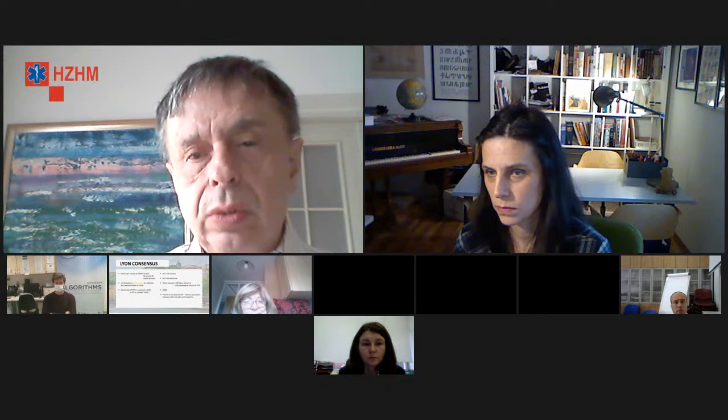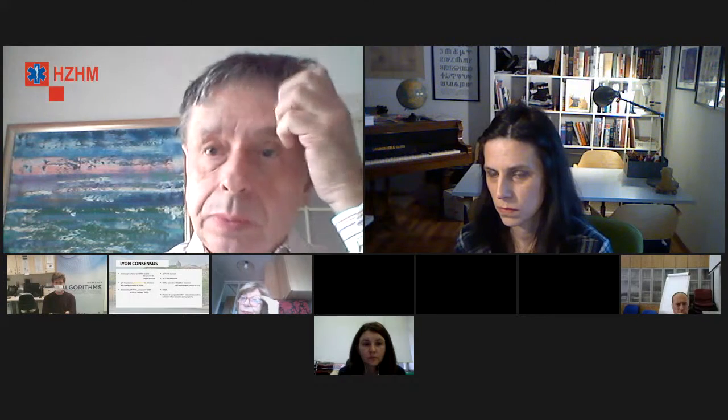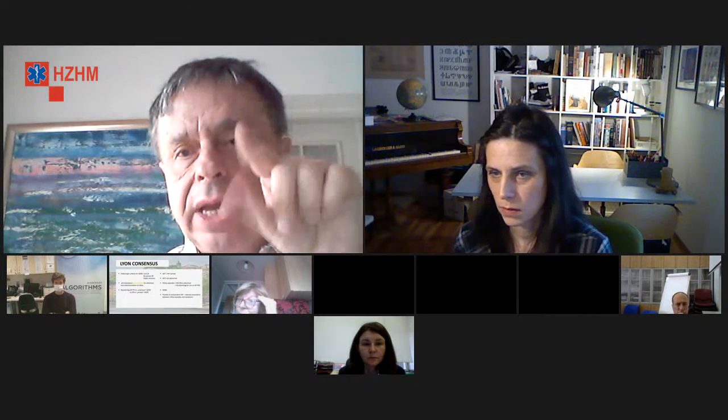Ali prvo treba biti oprezan kad se izvlači kateter, to su hemostatske klipse koje vam se potrgaju. Nekad treba čak i 2 provjere, pa to zahtijeva duži period odmora. Tako je i kod jednjaka kao i kod ovih drugih. Kad ne ide drugačije ili kad je ahalazija, onda jednostavno proguram taj kateter uz endoskop velikim aligatorskim kliještima i polako ga utiskujem unutra.